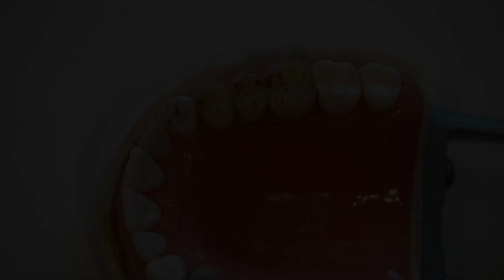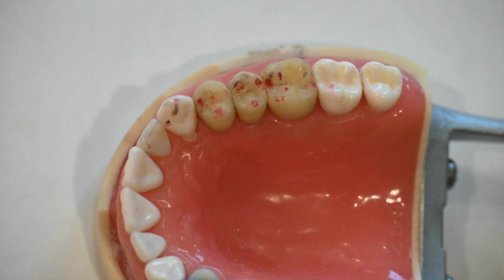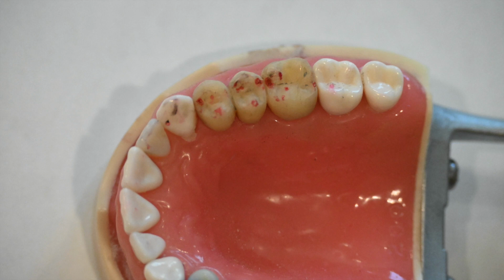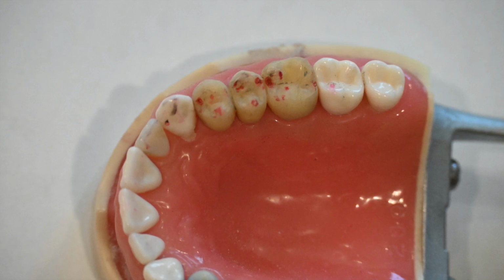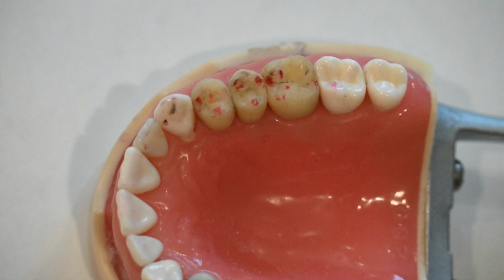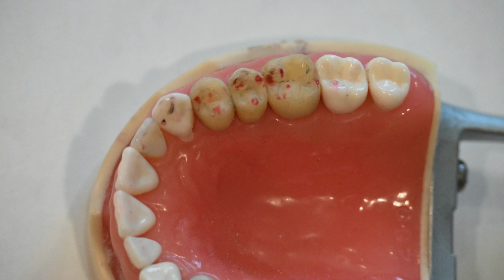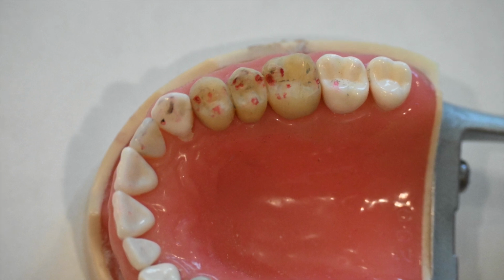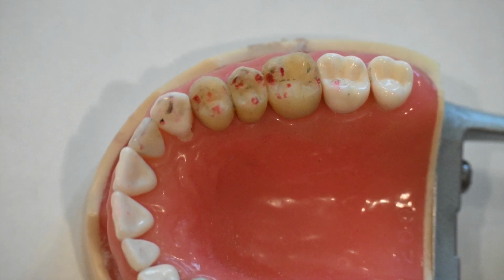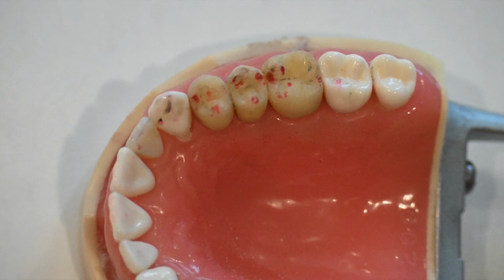Here we've removed our blue markings, finished some final contouring and polishing of our restoration, although not a final polish, and marked our landmarks with red paper, and you could see how nicely they mark and how our centric cusps, the palatal cusps, are nicely marked, and our lateral excursions are also nicely marked. This concludes our block carving exercise.